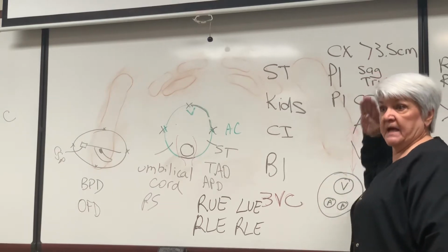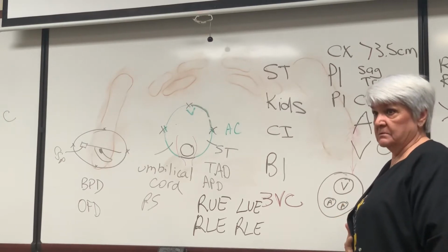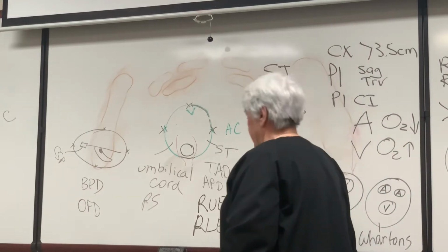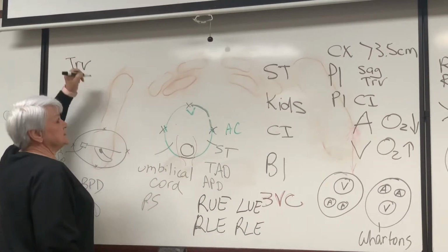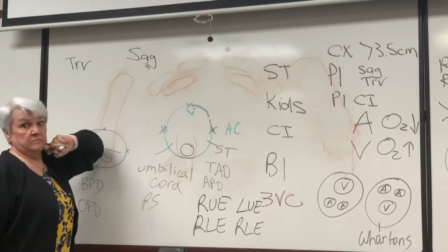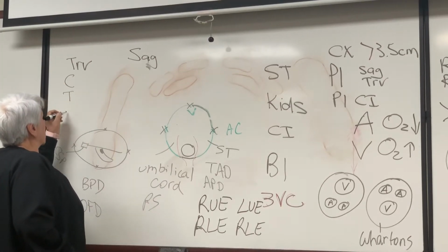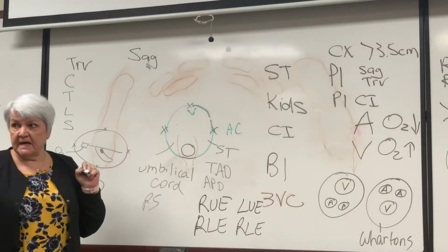Some sonographers start at the head and go all the way down. Myself, I look at everything internal. If my spine is up, I'll do my spine first. So, when I do my spine, do all of your transverses and all of your sagittals together. Don't go transverse, sagittal, transverse, sagittal, transverse, sagittal. I'm going to do C-spine, T-spine at the level of the heart, L-spine at the level of the kidneys, and S-spine. I'm going to get that nice little point.